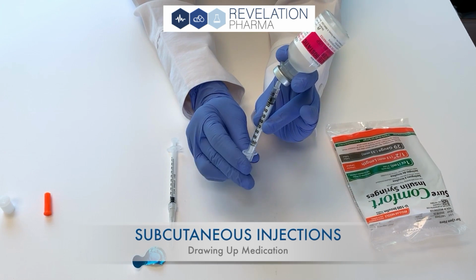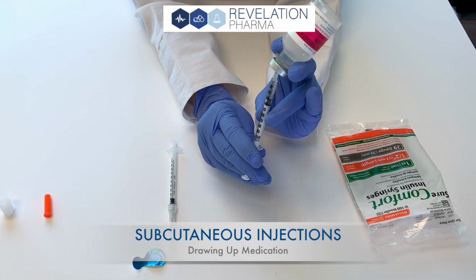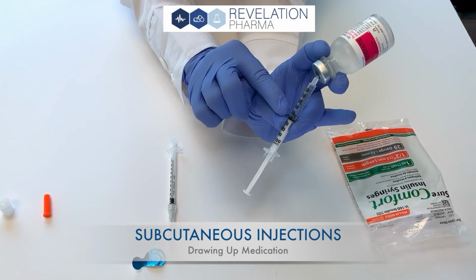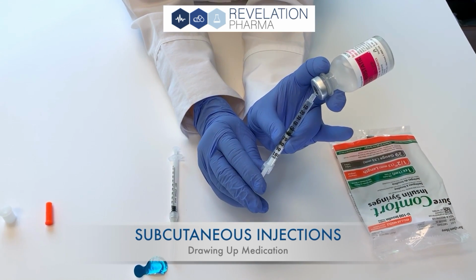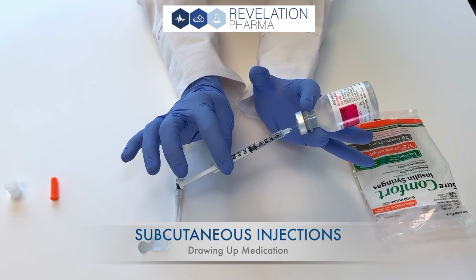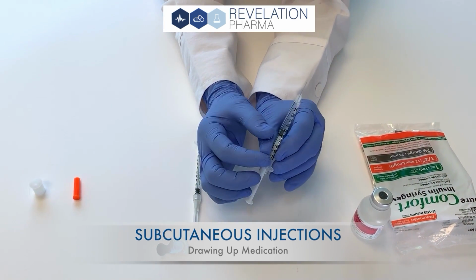If you are getting air bubbles in your syringe, you can push the medication back up into the vial and then continue to pull back down. Slowly draw back until the top black line of the plunger is at your specified dose. In this case, we're using 50 units or 0.5 milliliters. Once you have your specific dose, pull the syringe from the medication and check that you have your specific dose that we talked about.